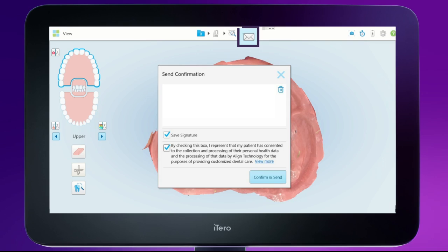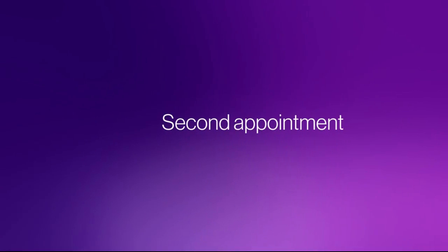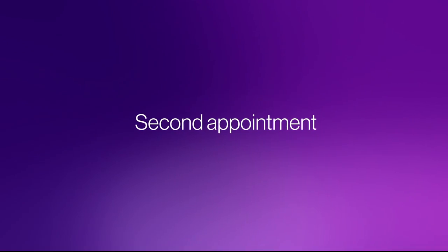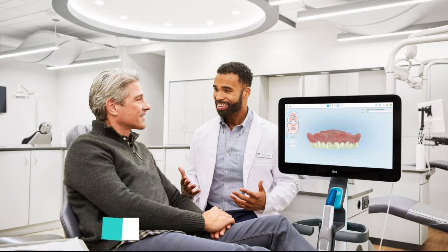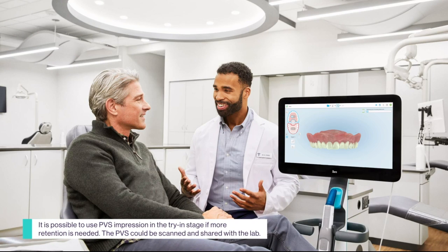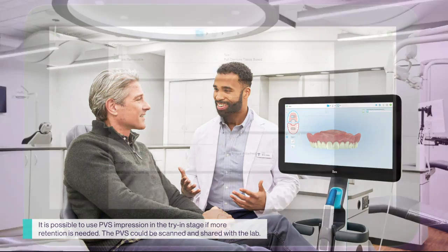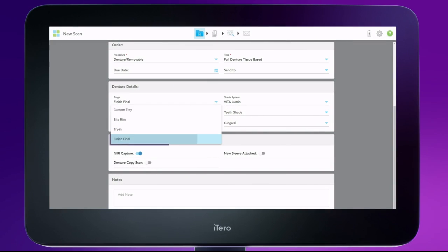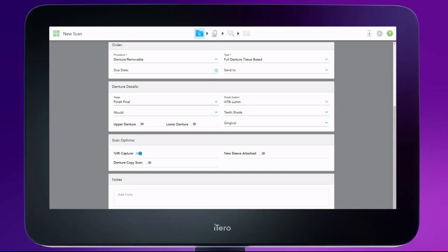Tap the envelope icon to send the completed scan to the lab. The main goal of the second appointment, or the try-in stage, is to check the aesthetics and functionality of the dentures. Start filling out the RX and choose the finish final from the treatment stages. Examine the try-in externally and internally. The try-in with adjustments can be scanned or physically sent to the lab.